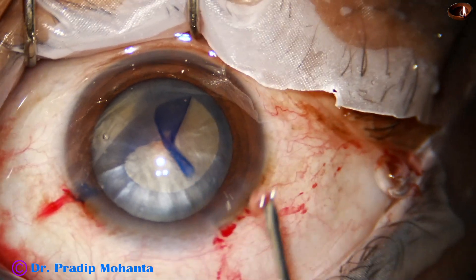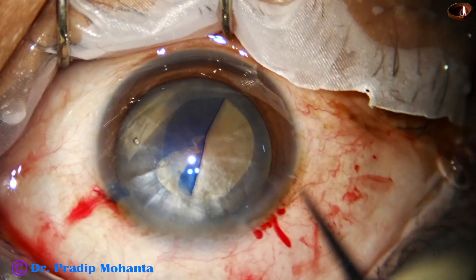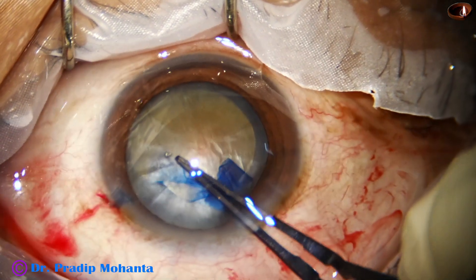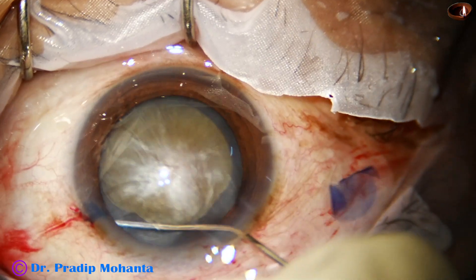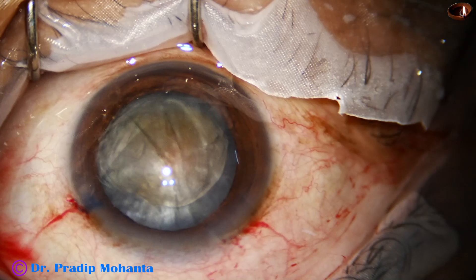Here, I inject viscoelastic to fill up the chamber again and continue the rhexis. It tended to go to the periphery at around 3 o'clock, but by a quick pull, I could retrieve the rhexis and bring it back on track.